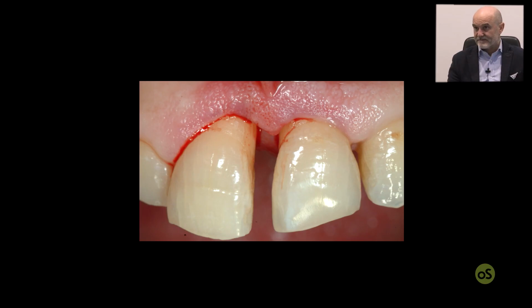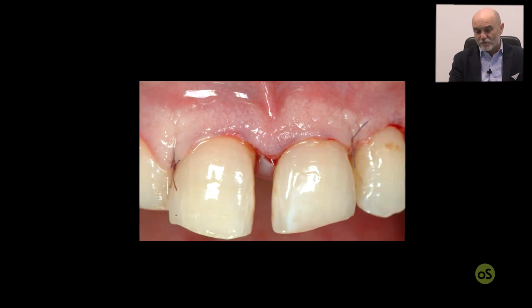And what is it? We just saw it. You have to open also the adjacent papilla, split thickness, submarginal, and since I am able to anchor my split thickness papilla in a more coronal position, you can see that in the same case, now the two papillae and the supracrestal soft tissue close not in apical direction, but exactly at the same level of the adjacent deepithelialized papilla.